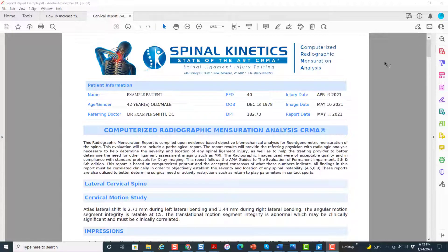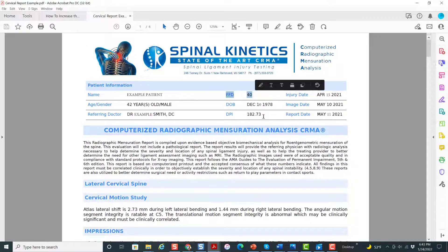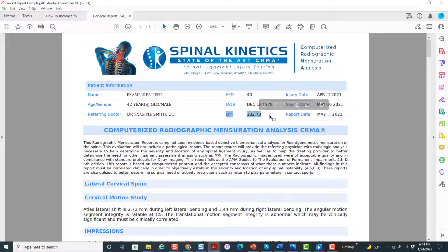The last thing I wanted to show you is we are the only service in the country that actually puts the DPI in the study. We're telling you exactly what the DPI is and exactly what the focal film distance is that's shooting this. Without those two pieces of data, our system calibrates exactly to this. And if it's not stated in the report, it's impossible to tell if the report is accurate. You can't use JPEGs for this, doctors. You can't use simple softwares — you have to have sophistication in what you're using, especially in today's digital world.